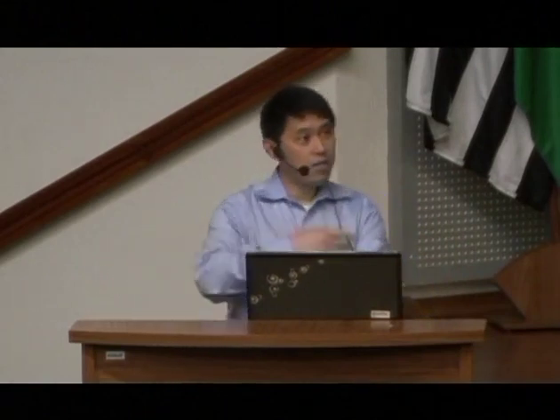So really, the best disease site to investigate, like Brian said, is the prostate. Those are much easier sites where you can have a more well-controlled light fluence rate, because you can put the light to wherever you want. That actually is a site I'm really looking forward to.